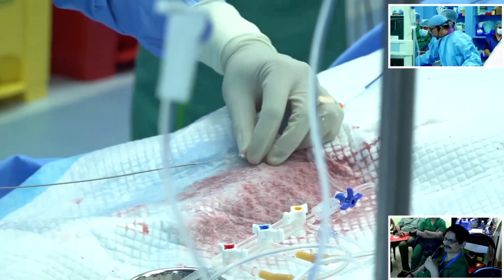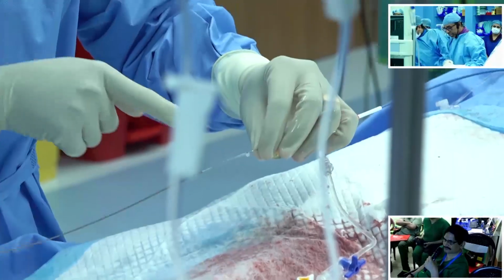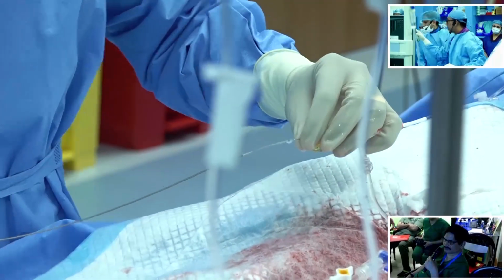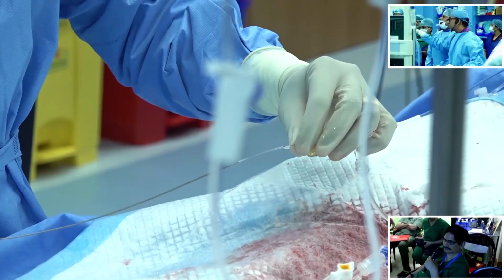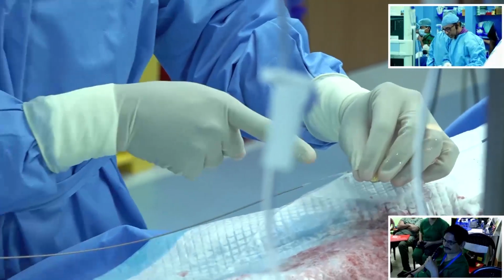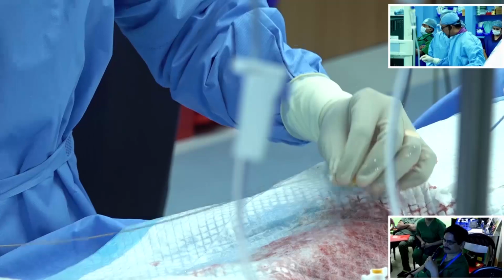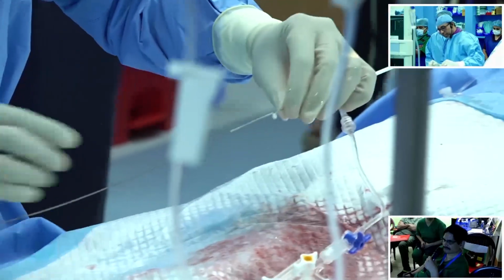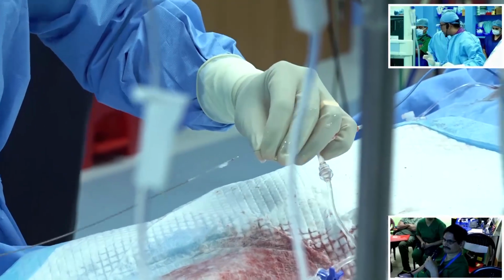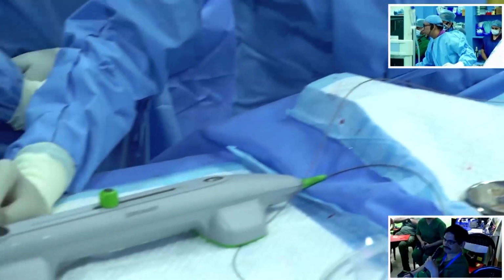Checking now the parameters, one, you can see that the drip rate is okay. We look at the pump, make sure that things are over. The saline bottle is good. The saline being flushed over here is adequate. It's flowing very well. Then we just rotate it and see whether it's rotating properly. So for that, can you focus on to this particular area?